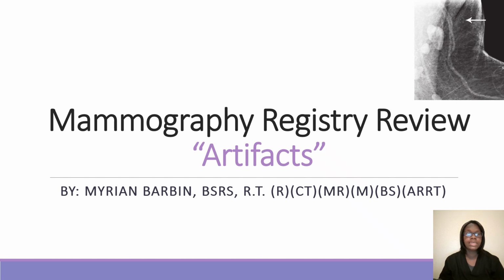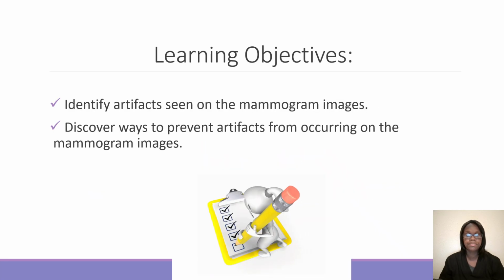Hello everyone. In today's video, we are going to talk about artifacts. So if you have seen some type of artifact on the mammogram image, could you let me know in the comment box what type of artifact you have seen? If you want to, you can also let me know how you went about correcting it.